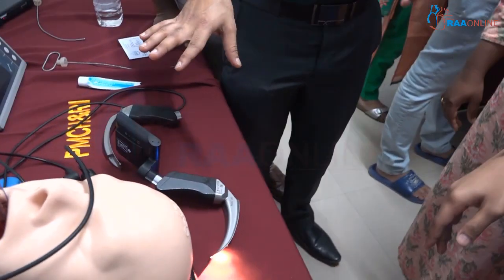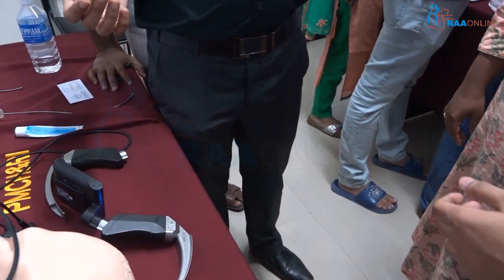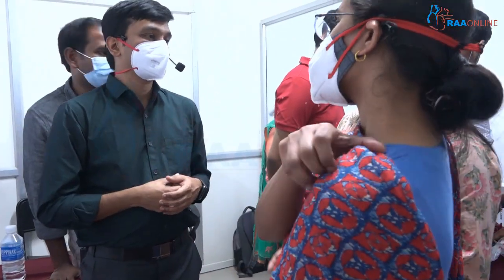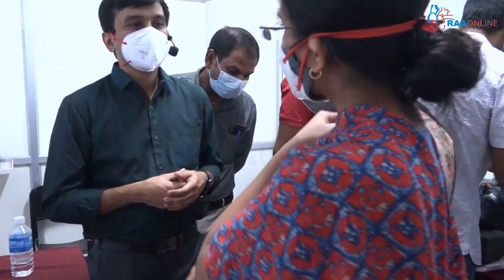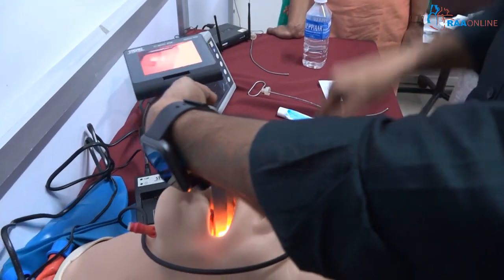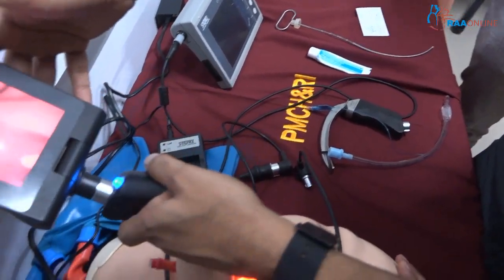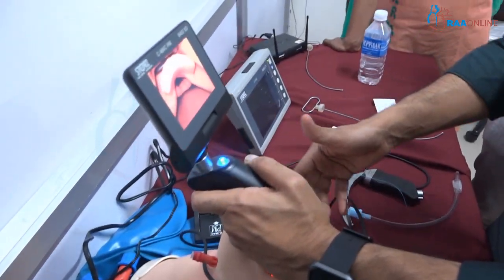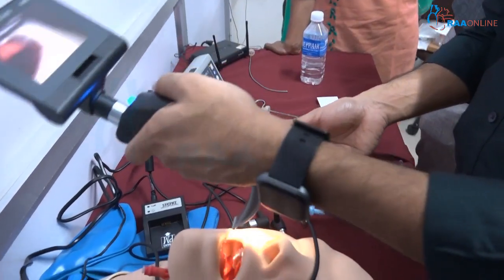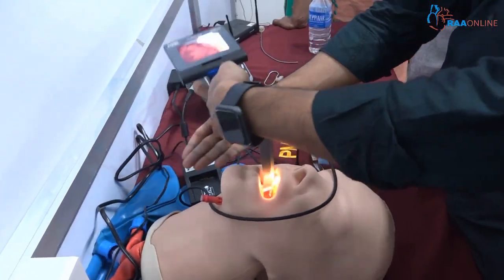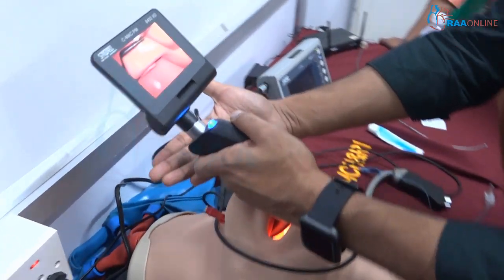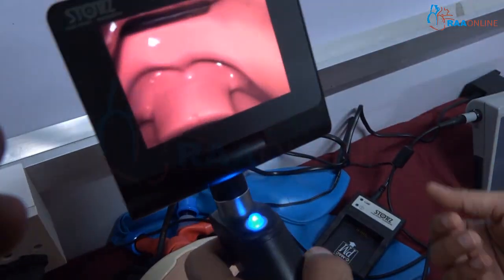Insertion can be difficult with Macintosh-type blades; angulated ones are easier in that regard. To overcome this, instead of inserting it straight, introduce the blade laterally — push the tongue from the side, go in, then bring it back to the center to get a good view. This way the blade doesn't interfere with your scoping approach, and you avoid hitting structures during insertion.